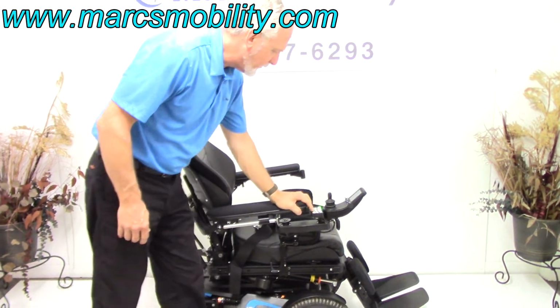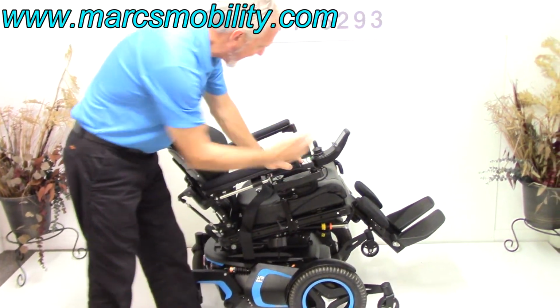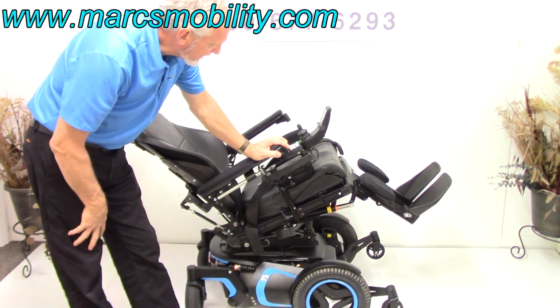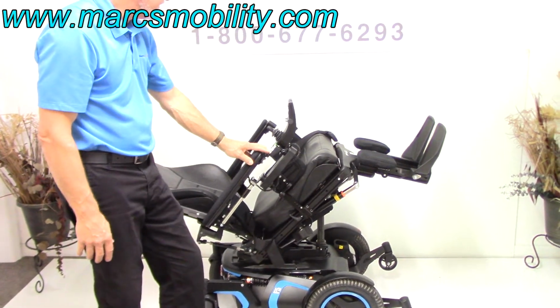Okay. The next thing we're going to do is the electric tilt. The electric tilt is when the seat, the base right here, tilts back. Of course, the back is going to go with it because it's a tilt. That's called your electric tilt right there. All right. It's a very quiet chair. So that's your electric tilt.